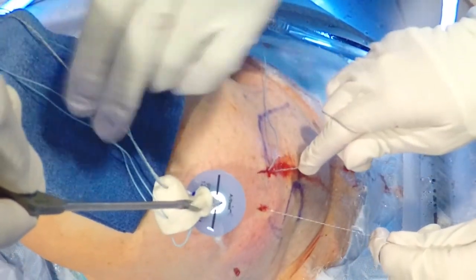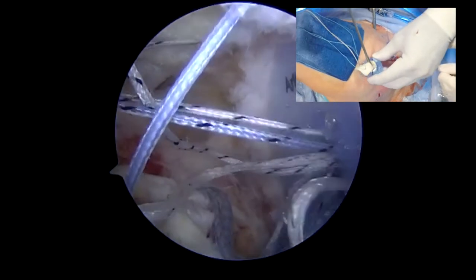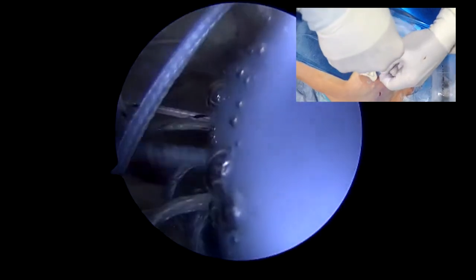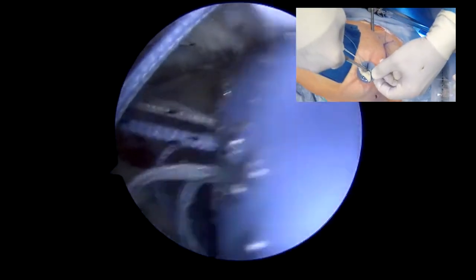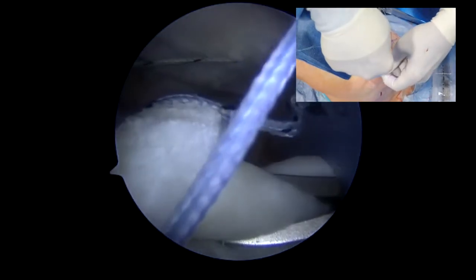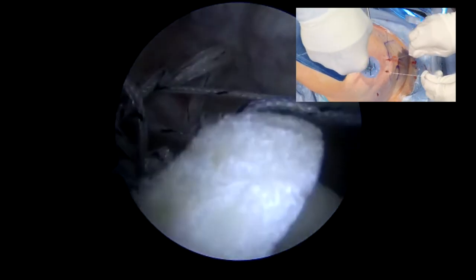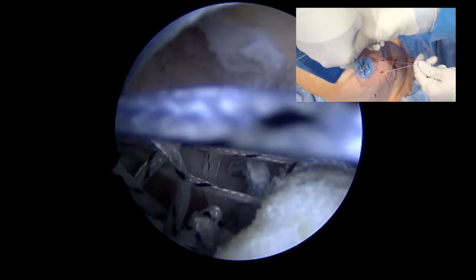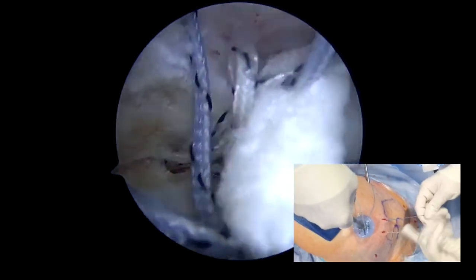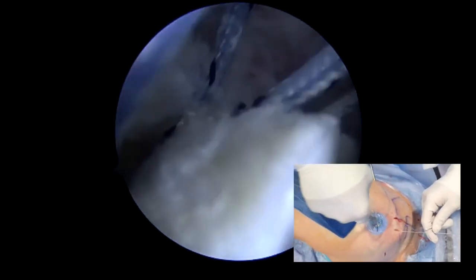Now we will grab the dermal allograft — this is done with a heavy needle holder — and we will fold it, like a New York hot dog, and pass it manually through that portal, pulling on the sutures to maintain tension. That's the most medial aspect of that allograft, and we are taking up the slack with the sutures and then bringing it down to the superior glenoid rim.